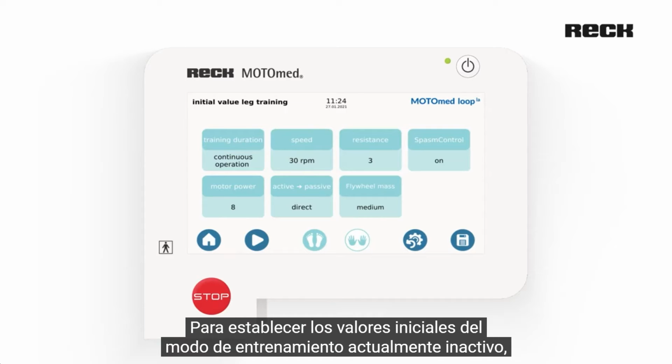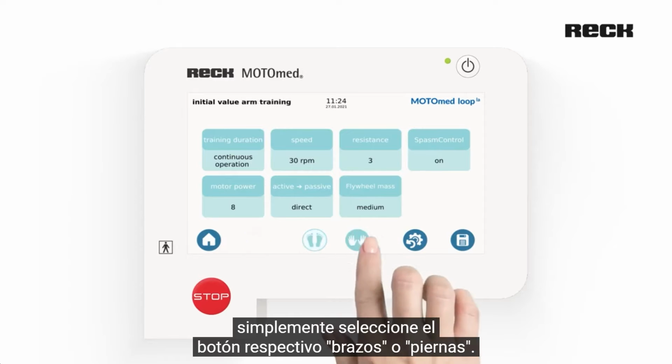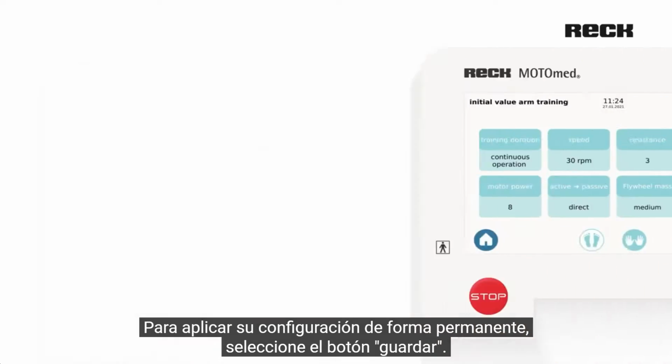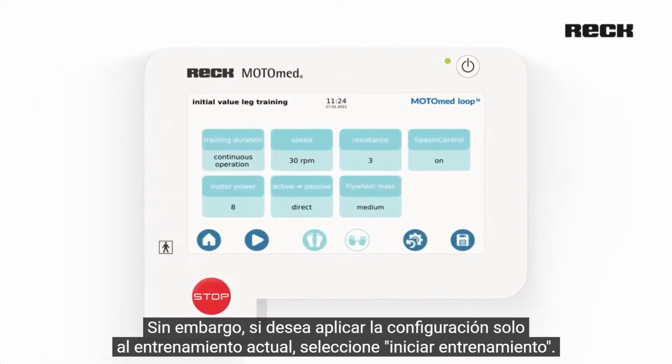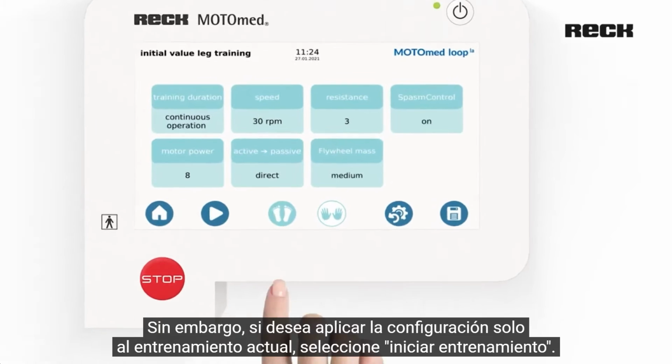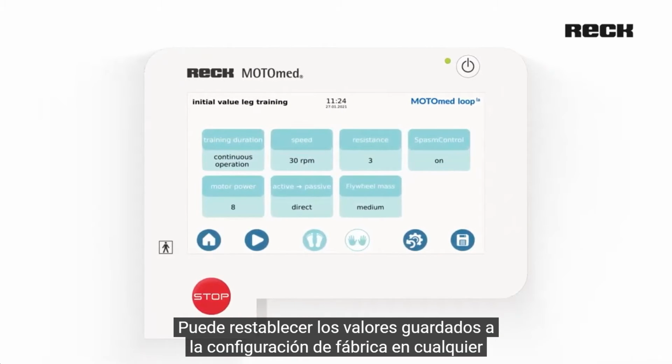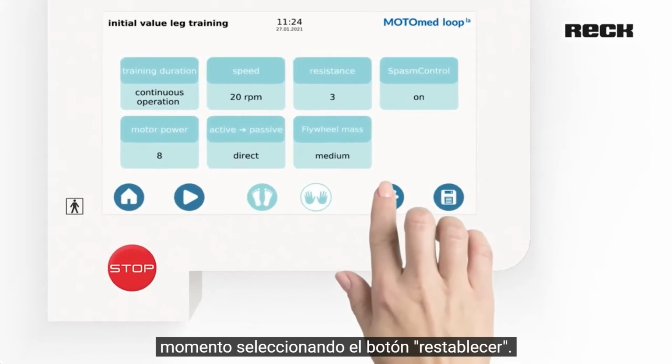To set the initial values of the currently inactive training mode, simply select the respective button, arms or legs. To apply your settings permanently, select the Save button. However, if you want to apply the settings only to the current training, select Start Training. You can reset the saved values to the factory settings at any time by selecting the Reset button.